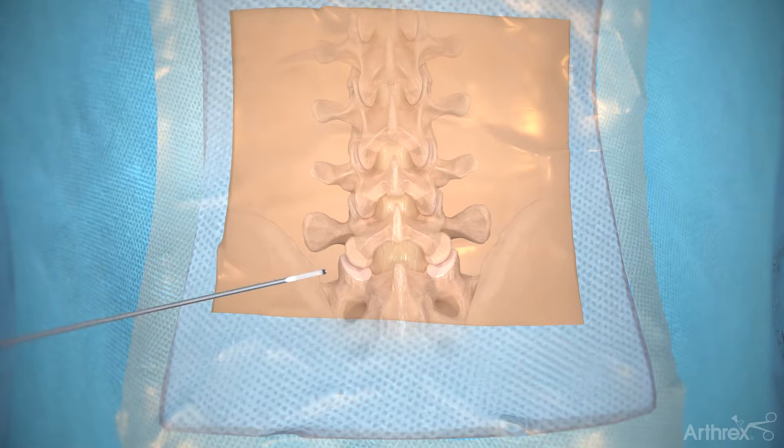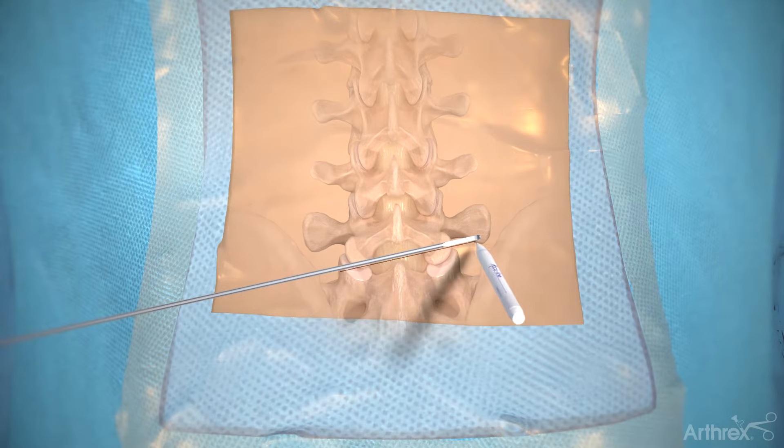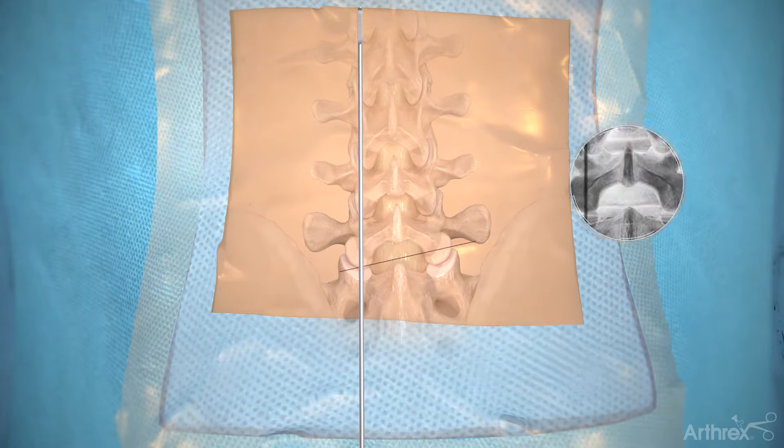Start the procedure by finding the entry point using an elevator and a pen. First, mark a horizontal line from the ipsilateral pedicle to the contralateral foramen. Next, mark the facet line.